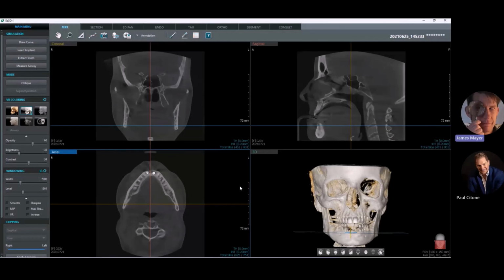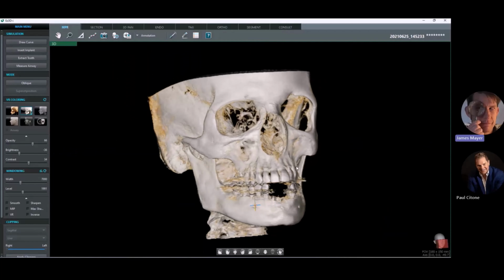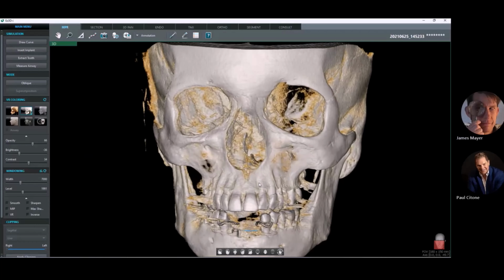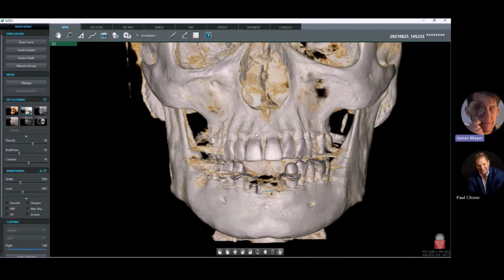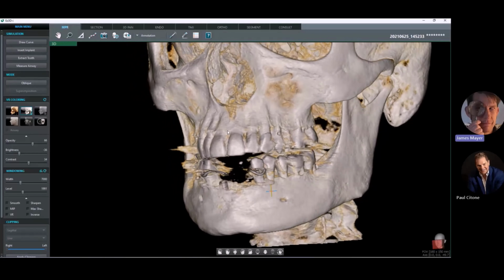Now let's look at a little bit of distortion, or artifact, that you see in scans, highlighted as scatter in the images. I'm going to enlarge our 3D rendering here. Off of any dense areas, you can see a little bit of scatter or streaking effect in the image. We have compressed sensing technology to reduce that, but you're going to get a little bit of scatter in the data sets, and that is the nature of cone beam right now.